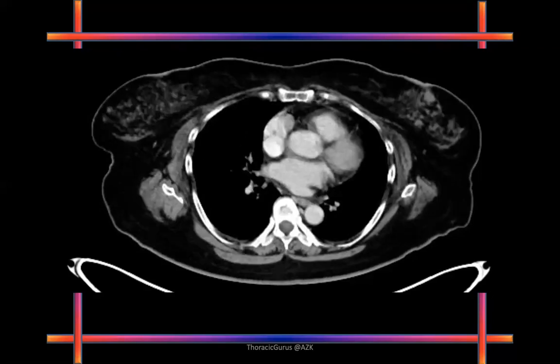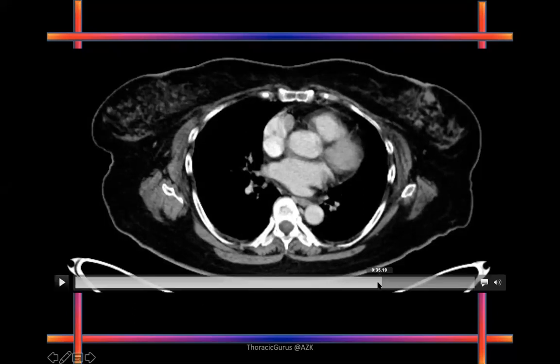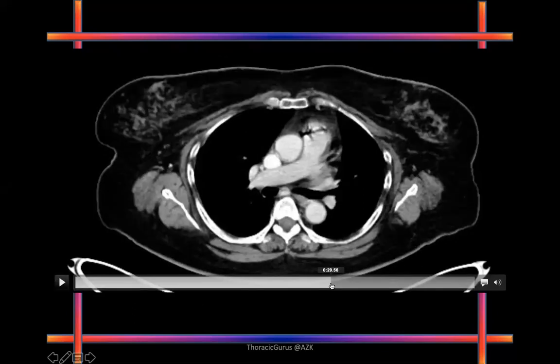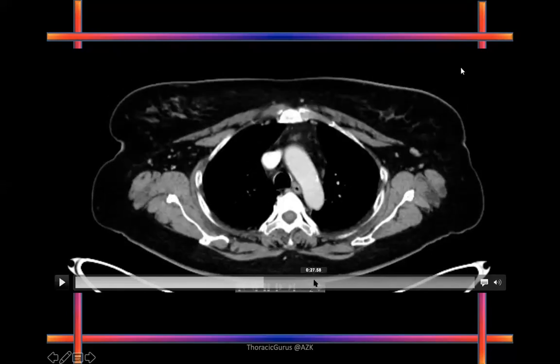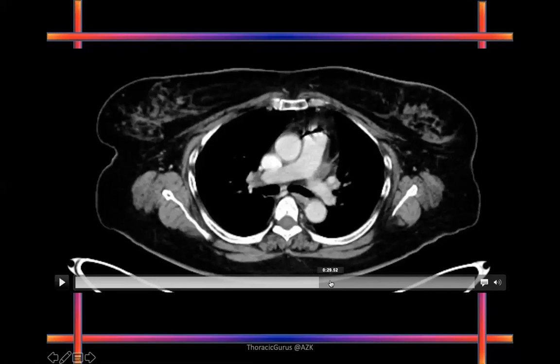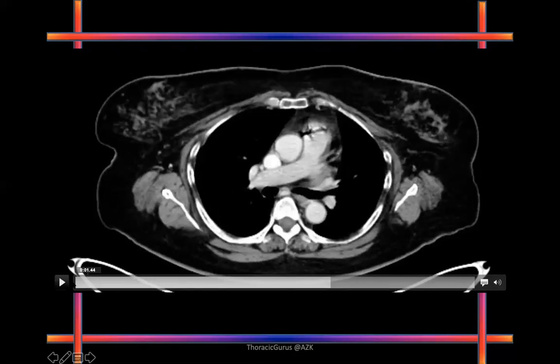Where are you? Okay. So we're entering the right atrium now. Excellent. Very good. Simple. Isn't it? Not difficult at all. Can you identify that one structure, which is the right atrium? Excellent. Now we go back a little bit and I want you to see the other structure that is coming into view.